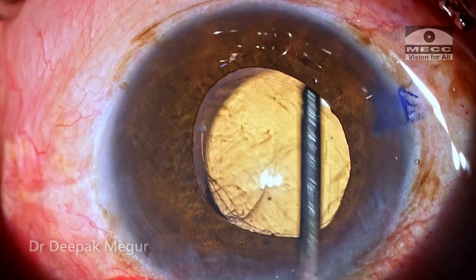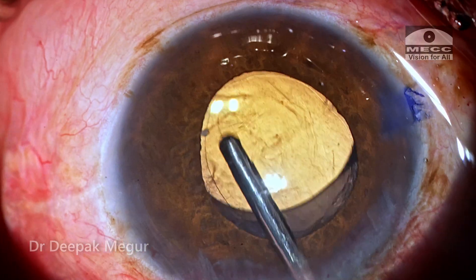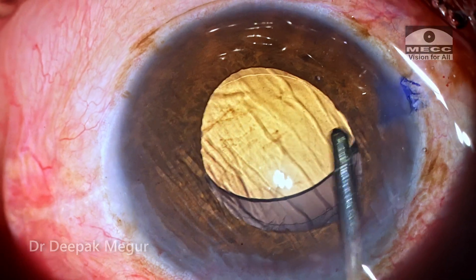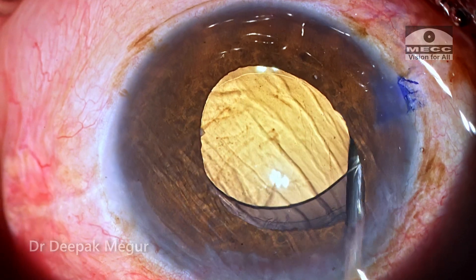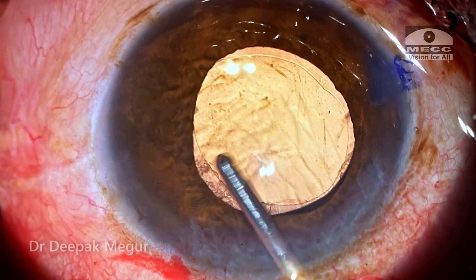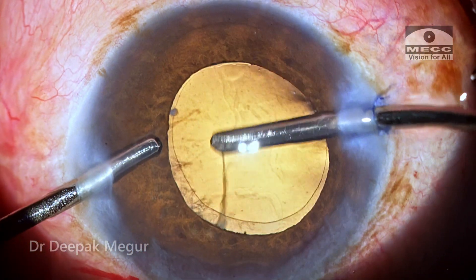Time to remove the OVD. I'm tilting the lens up to slide my irrigation cannula under the intraocular lens to rinse out all the OVD inside the bag and also the OVD sticking to the posterior surface of the intraocular lens. Passive irrigation flushes out most of the OVD inside the bag, then the OVD in front of the lens is aspirated, along with some of the remaining cortex.